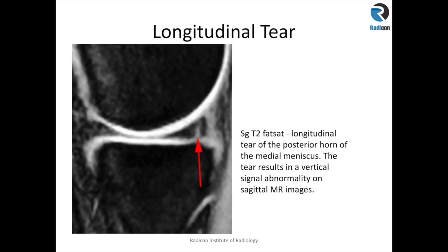This is an example of a longitudinal tear where the red arrow shows signal change which reaches the undersurface of the meniscus. The appearances are suggestive of an undersurface longitudinal tear, and this is at the periphery, so it can heal by itself as there is peripheral vascular blood supply to the menisci.